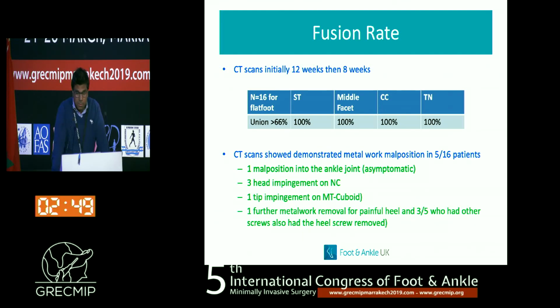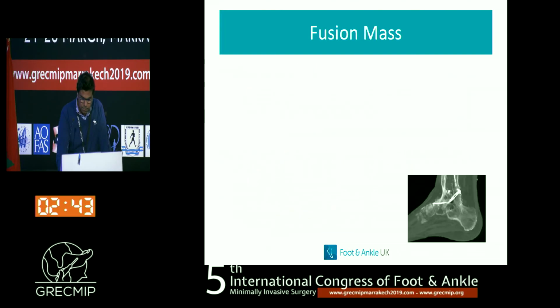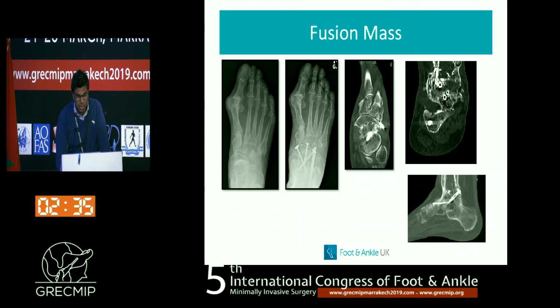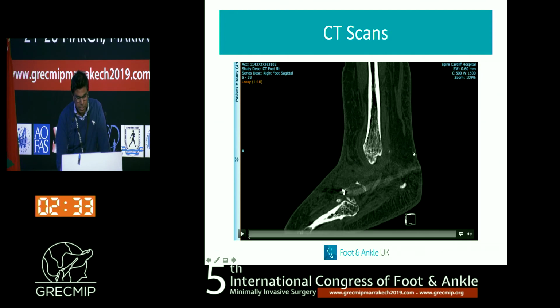And some of them were asymptomatic and had not been spotted at all on the X-ray, including one that was impinging on the ankle joint. But as this was diagnosed at 8 weeks, it was easy to remove this. The fusion mass that occurs with this is really impressive. There's really good bone healing.